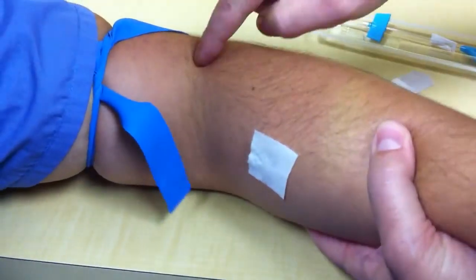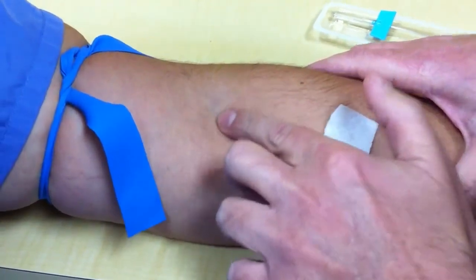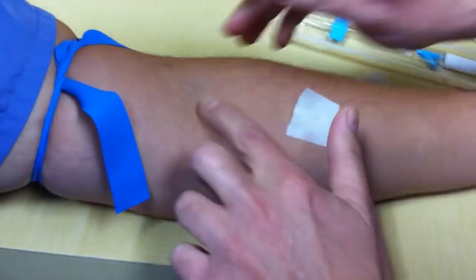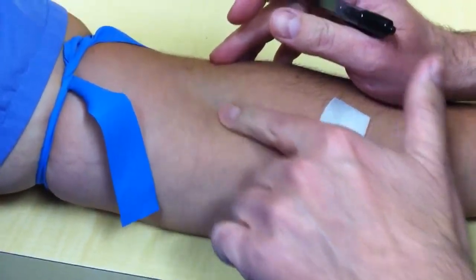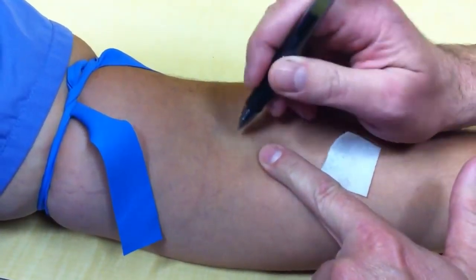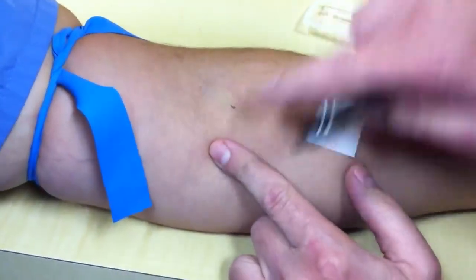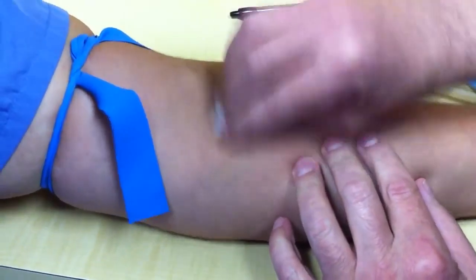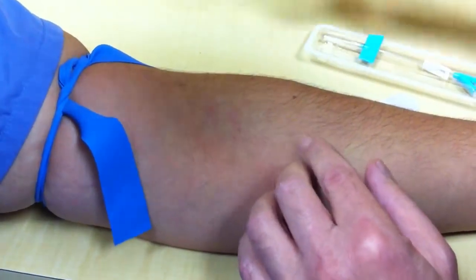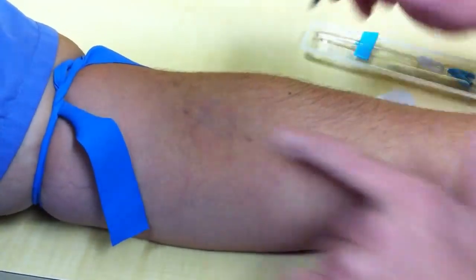You see where the elbow crease is? That's where you're going to see it. In this case, we have one right here. One really good thing to do is to feel with your finger the direction that the vein is going. In this case, the vein is going this direction. So one thing I do is I'll put a dot with an ink pen where the ends are so I know what direction to put my needle in.